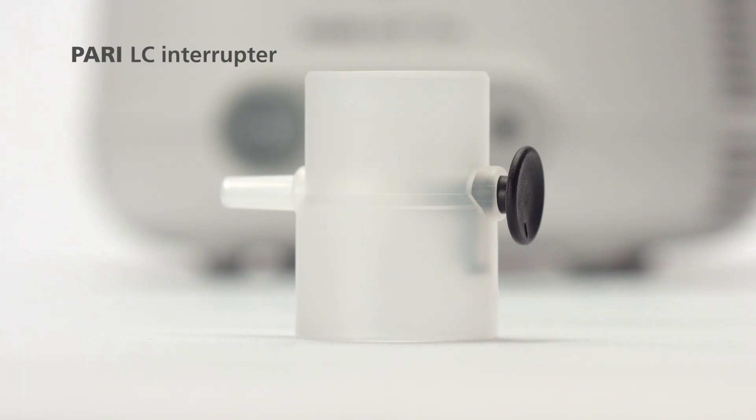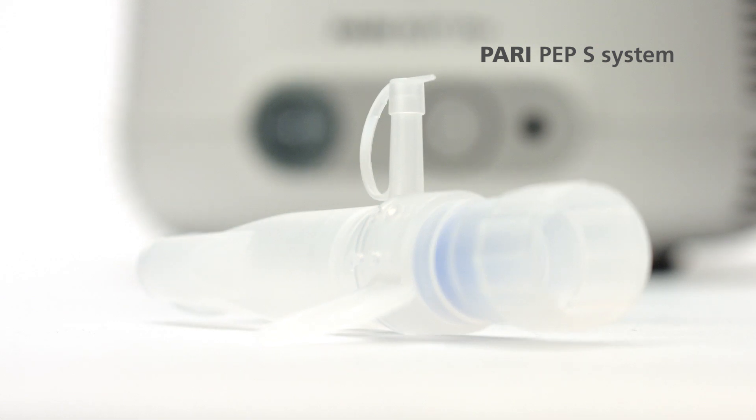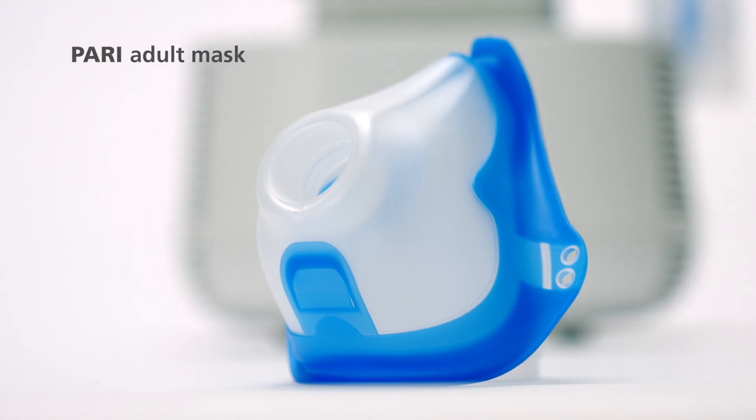The PARI LC interrupter for optional intermittent nebulisation. The PARI PET-S system for physiotherapy can be used separately or in combination with inhalation therapy. And the PARI adult mask.